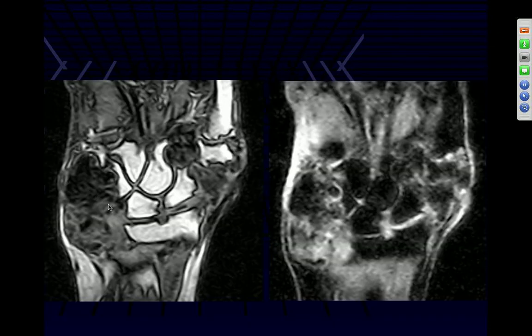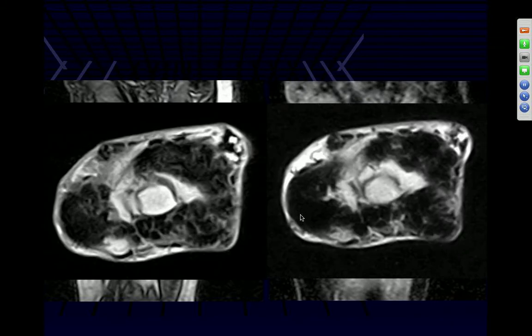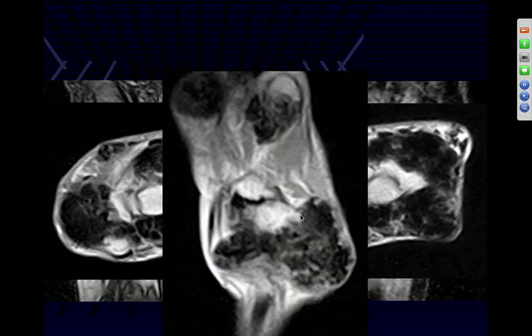Here's another lesion of low signal intensity on the gradient echo T1 weighted images, also mostly low signal intensity on the STIR images on this low field scanner. See it marked around. It's typically fibrosis or a calcium deposition in these lesions to be this low. And this was actually scleroderma.